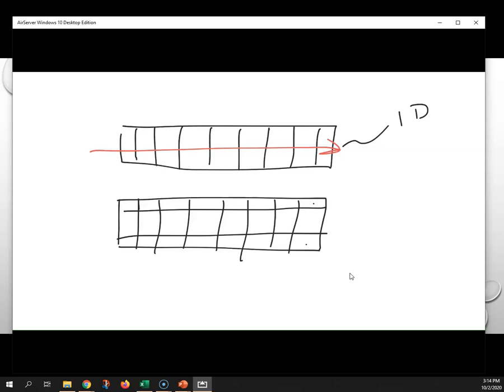Okay, so let's take a look at this thing up top from the side. From the side it looks like that. It's a single crystal, and it may have a little bit of shape to it this way, where the manufacturer has curved it in order to shape the beam in the elevational plane.